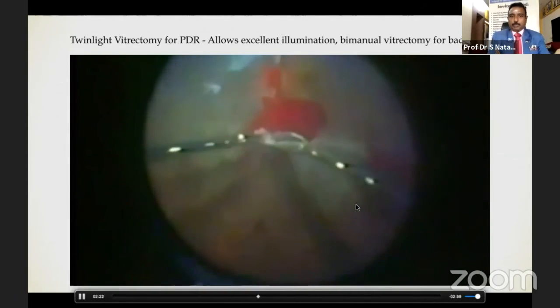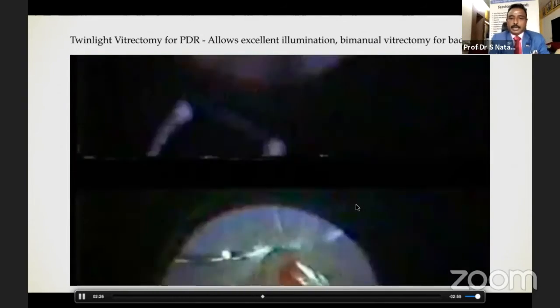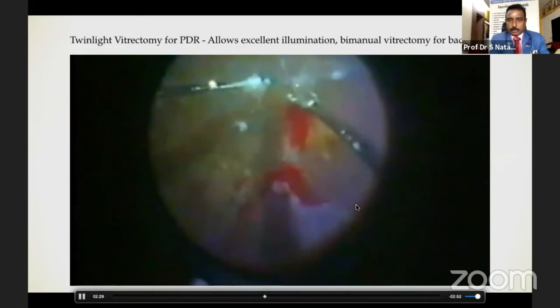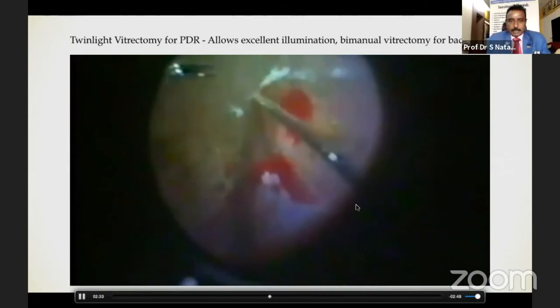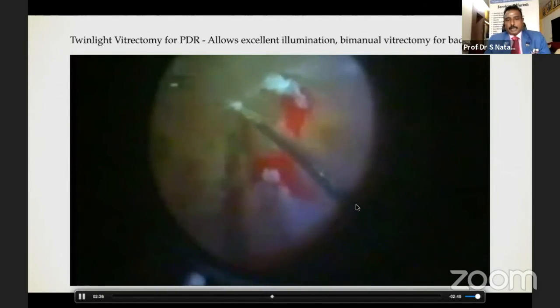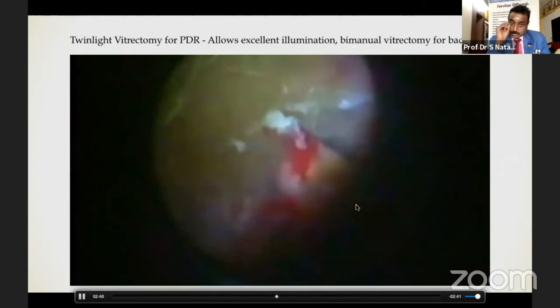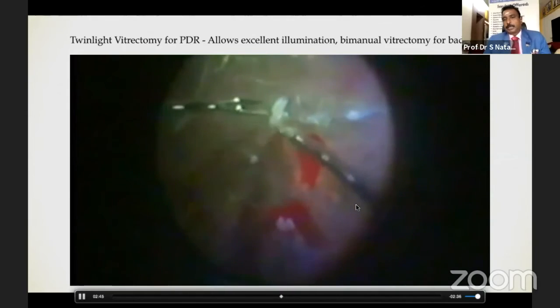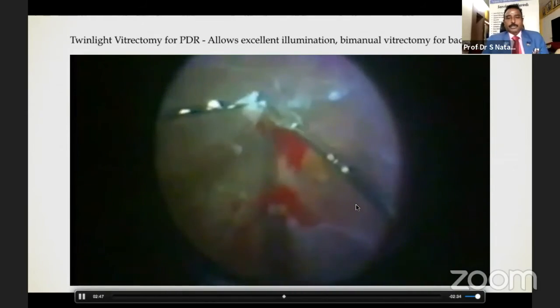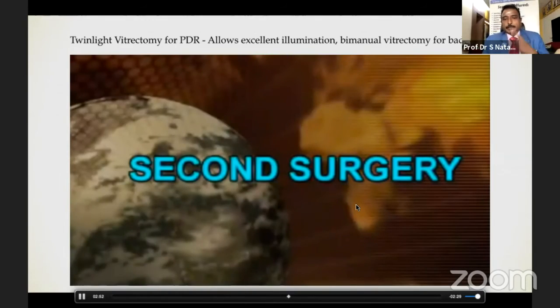The last part is being removed. I think in the 90s, there was a 19 to 20% risk of iatrogenic retinal breaks, and now I think it has reduced to the minimal, and that's because of advanced illumination, advanced viewing systems, as well as advanced vitreous surgery and micro instruments, which make the complications lesser. We can't say complication is zero, but complication is lesser, and the least complication is what a surgeon should aim for.